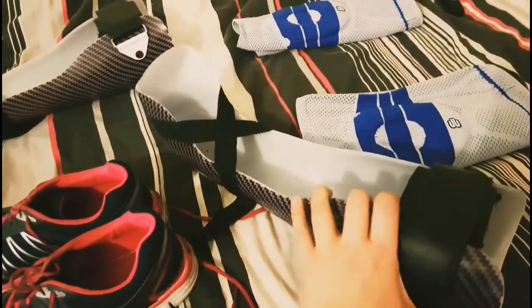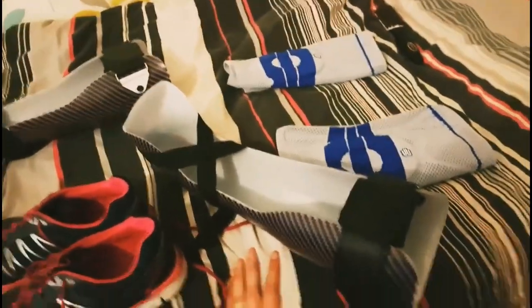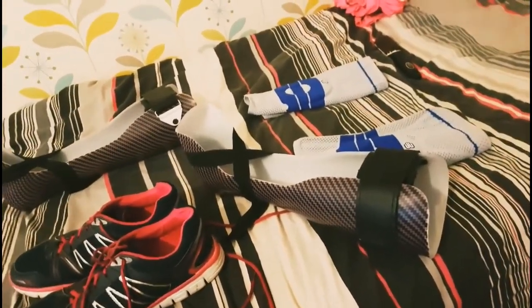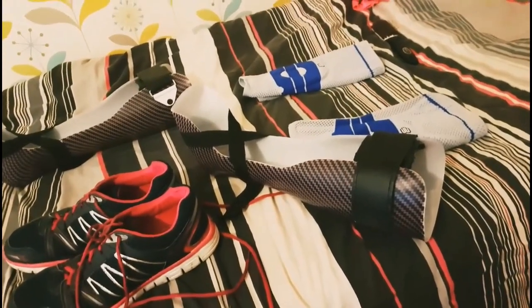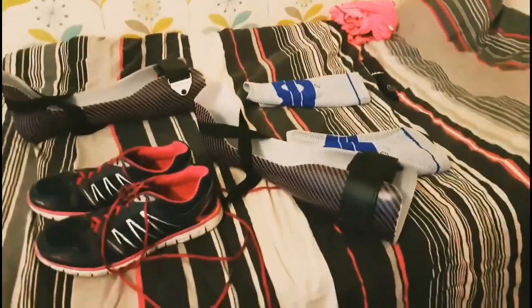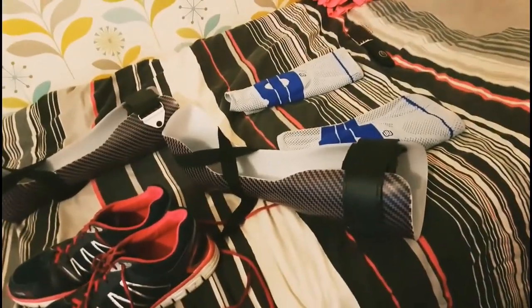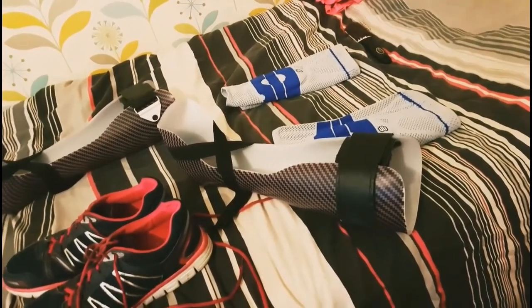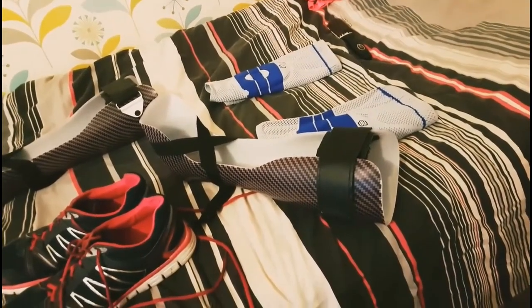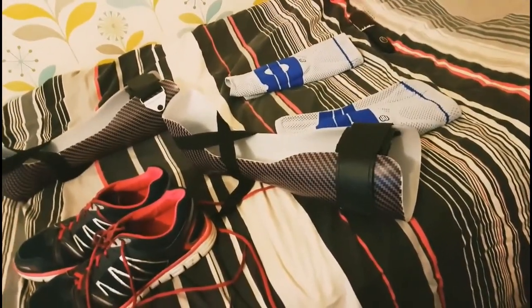These are, as I said before, AFOs, ankle foot orthosis. You have to be molded for these. It's actually the same department in Musgrave Park Hospital that makes the prosthetic limbs, or the sockets for the prosthetic limbs. They also fitted me for these. Basically, I had to get a plaster cast mold taken. And then I had to wait for about 6 months, as I said, to get another appointment. Even though it only takes 2 or 3 weeks for these to be made.